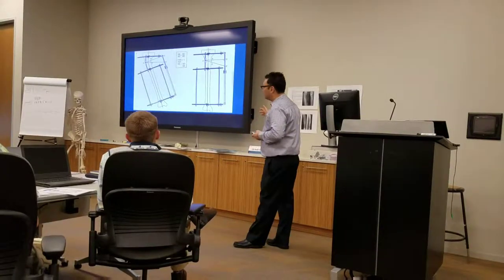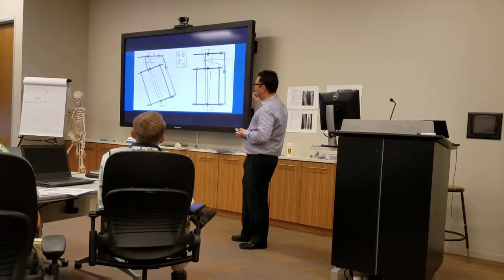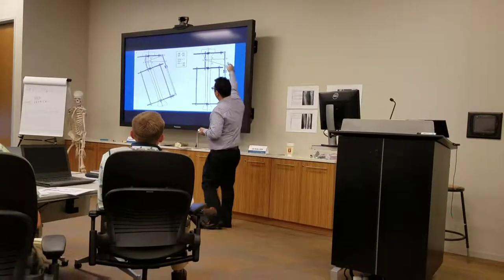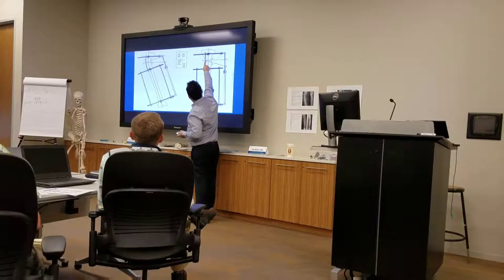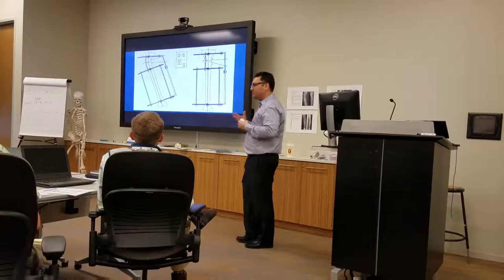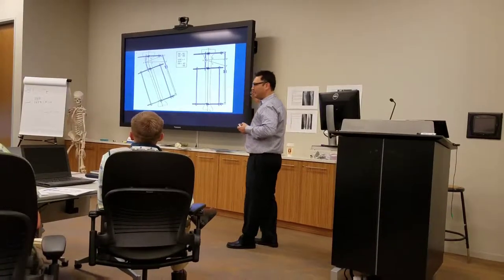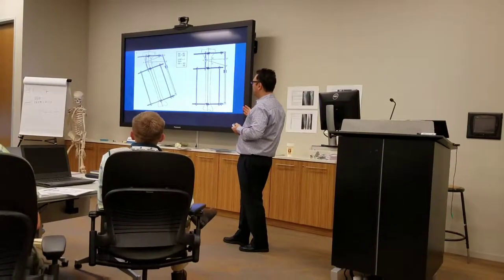This is published in Herzenberg. This is really a formula, an old formula to figure out the rate of correction. You have to realize that the deformity is going to correct faster over here than over here, than over here, and the skin's like over here. So you have to realize where your rate of correction is. It changes at different distances from the apex of your deformity, and these are things you have to keep in mind.